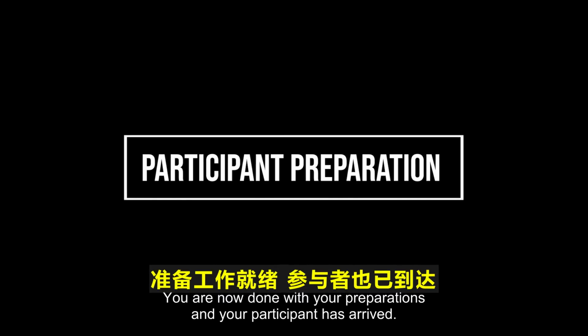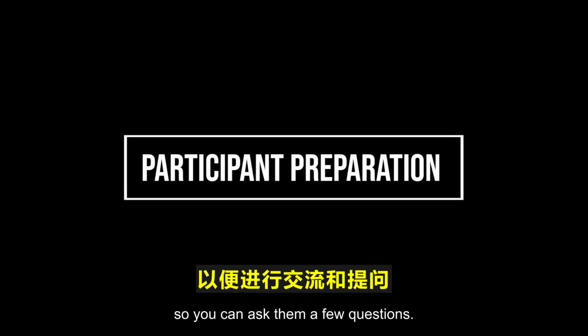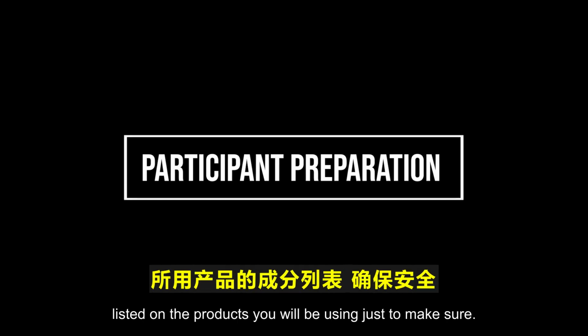You are now done with your preparations and your participant has arrived. Hopefully you will get to test someone who is a little more than a disembodied styrofoam head, so you can ask them a few questions. Make sure you ask them whether they have any skin allergies that you should be aware of. If needed, let them read the ingredients listed on the products you will be using just to make sure.